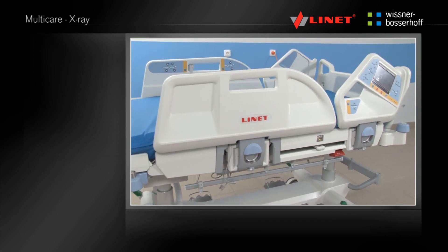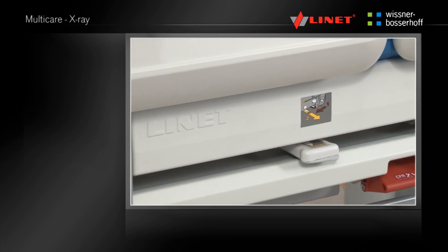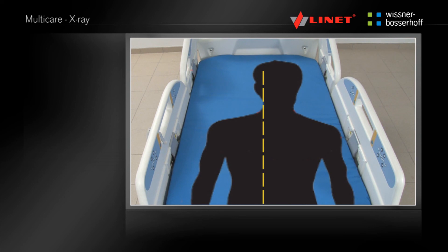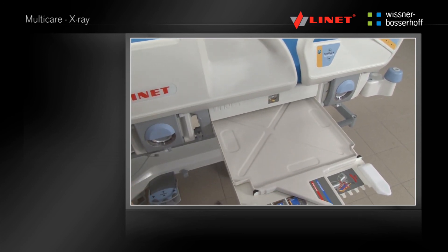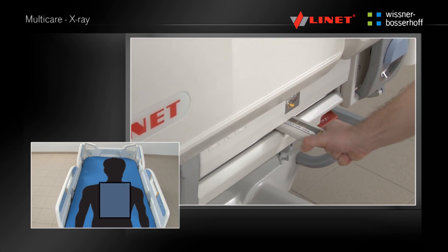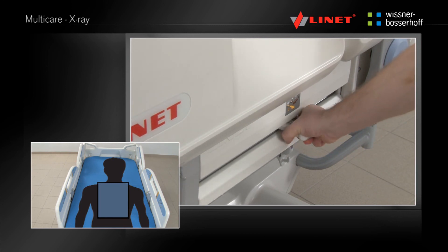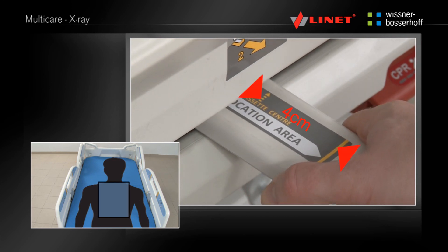The X-ray cassette holder for chest examination is located on the left side of the bed under the backrest. Make sure that the backrest is flattened, the side rails are up and that the patient is lying centrally in the bed. Pull the X-ray cassette holder out. Place the 43 x 35 cm X-ray cassette into the holder, deciding on either a portrait or landscape view, then replace. If the yellow arrow on the handle of the holder matches the line on the mattress platform, the X-ray cassette is in the middle of the bed. The cassette can also be positioned closer to the foot end or head end. The aim is to centre the middle of the cassette with the middle of the patient's breast bone.